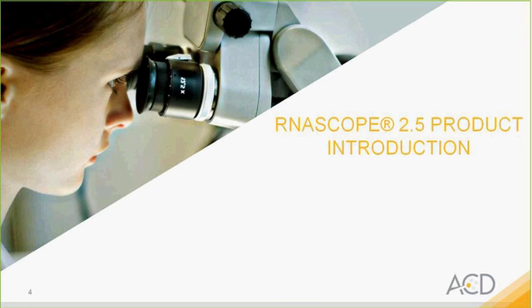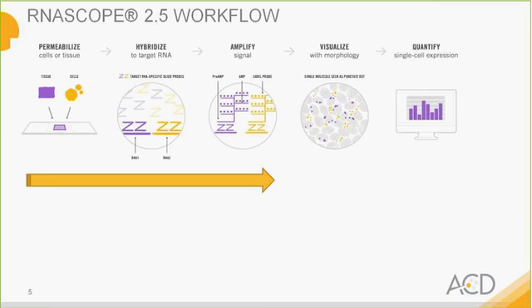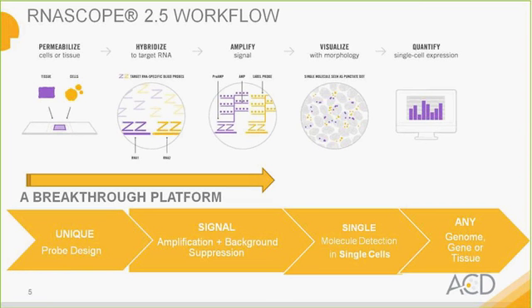And now a basic introduction to RNAscope. RNAscope is based on a proprietary in situ hybridization technology based on a unique probe design and signal amplification. This platform has a sensitivity to detect most genes in situ, as well as simultaneously quantifying multiple RNA transcripts.